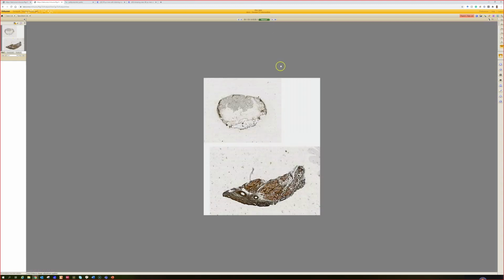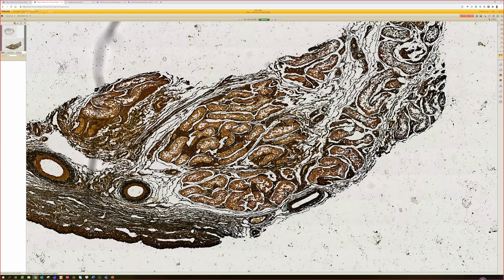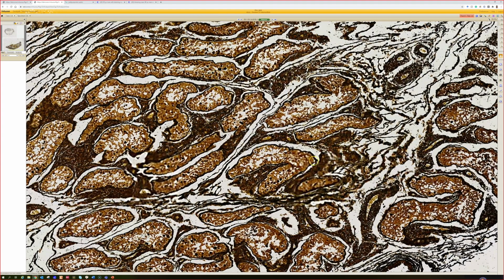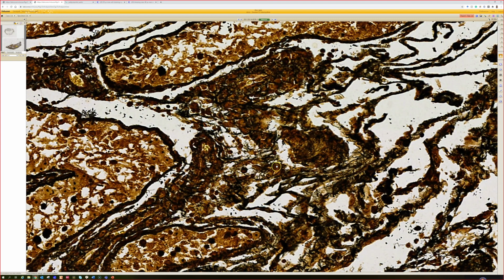Okay, next is, look, we're just going to skip over this one or go really quickly. I'm not going to ask you. This is a rabbit testes, and the rabbit testes can grow spirochete organisms and can be used, I don't exactly know how this is done, but this is used as control tissue for syphilis, because getting actual samples of syphilis, thankfully it's becoming, even though the cases are rising nowadays, it's still not something that we have tons and tons of extra tissue on hand.